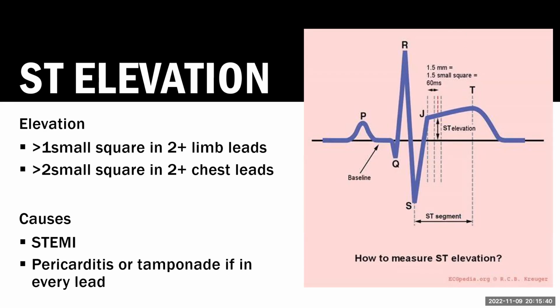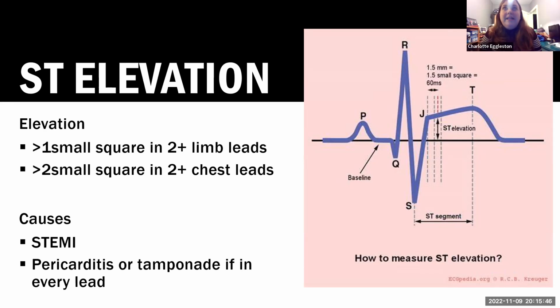How can we diagnose the pericarditis or tamponade other than the ST elevation from ECG? So from an ECG, there's probably not that much difference. They might be slightly tachycardic for both of them. The other things, if I was concerned, some of it's going to be history.